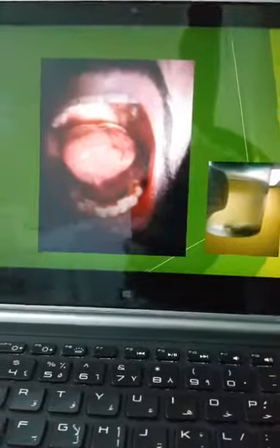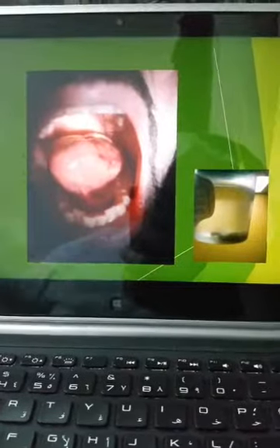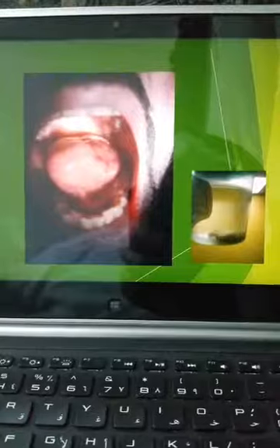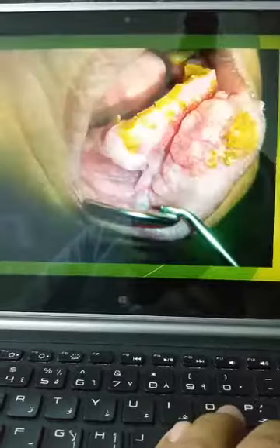And if you use diathermy, you're not going to get the best result if you compare it with the laser. Less damage. The coagulation zone here, you are talking about 50 microns only. And I doubt that you have a tool that can give you this minimum coagulation zone.